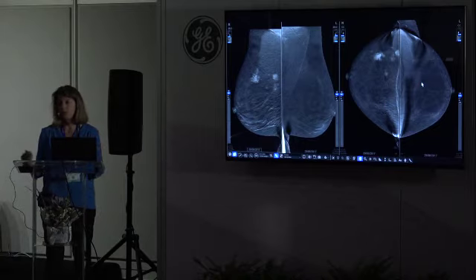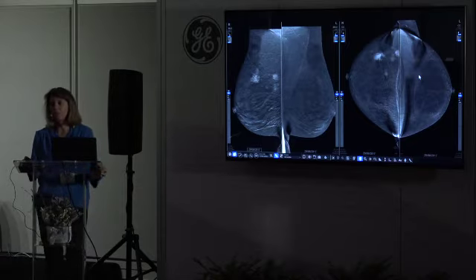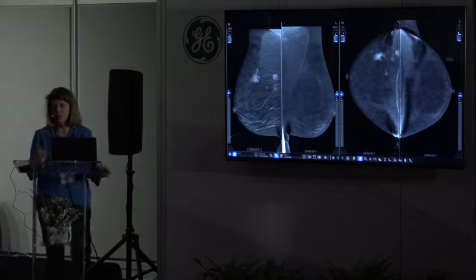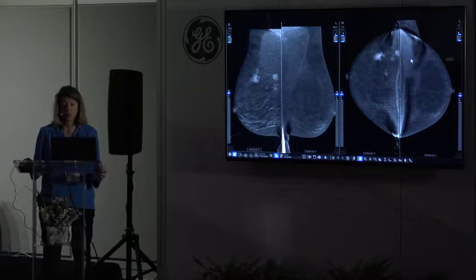And of course, for surgeons, it's very easy to understand because they have only four images. They look like normal mammography, so it's quite efficient. In my institution, the surgeons and oncologists regularly prescribe contrast mammography. We do also MRI, but for them it's quite normal to make a prescription of contrast mammography.